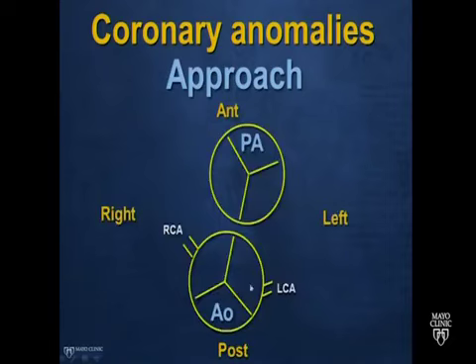Now, again, if we look at the relation between the aorta, as one sees here, this is where the normal origin of the arteries would be in this scheme. So this is the right, the patient's anatomic right, and this is looking from the foot of the patient. This is the right coronary artery here. Here's the left coronary artery. Here's the pulmonary artery up here.